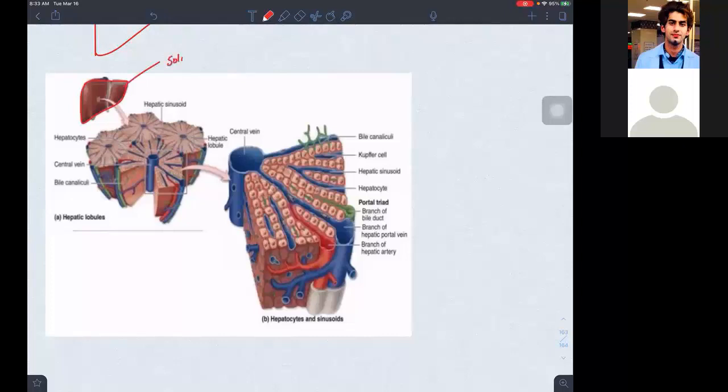It is a solid organ, and we have units forming this liver, the hepatocytes, the parenchyma of this liver. And we have seen there are some portal tracts. Can we see the portal tracts? Can we see some blocks like pies? Okay, we can see some pies.